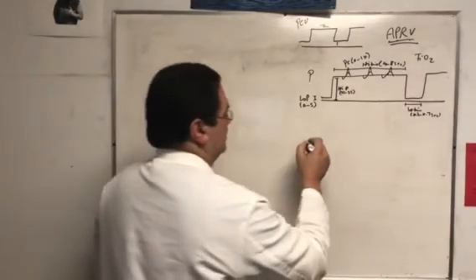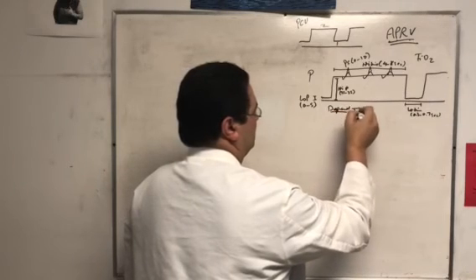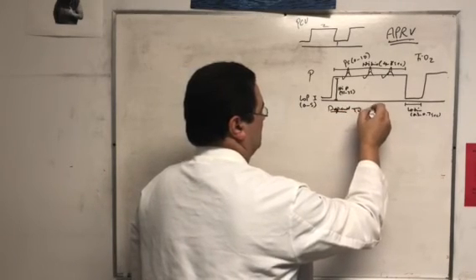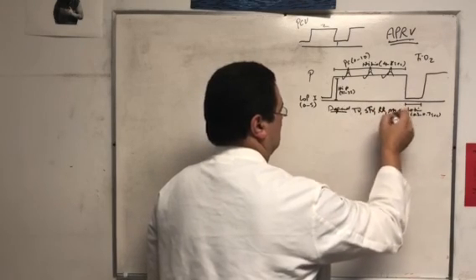All right. Now the dependent parameters. So this is the set parameters. Dependent parameters are tidal volume, spontaneous tidal volume, also respiratory rate, mean airway pressure. All of these things are dependent parameters.